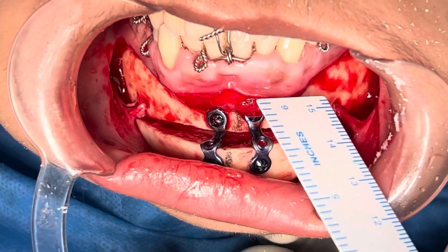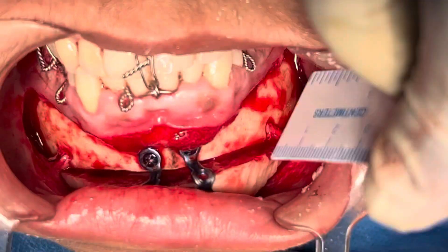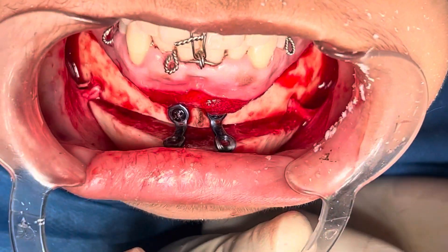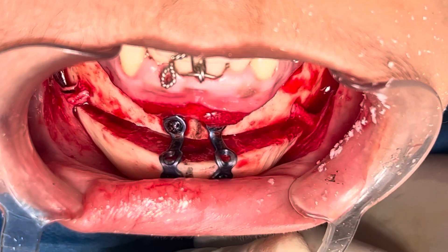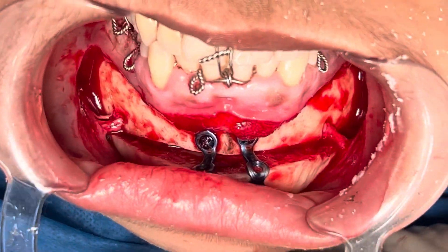We've fixed the genioplasty segment here. We've advanced it by 10mm. This is a classical sliding advancement genioplasty — only horizontal augmentation, no vertical augmentation whatsoever. That's what was needed for the patient to get better proportions.